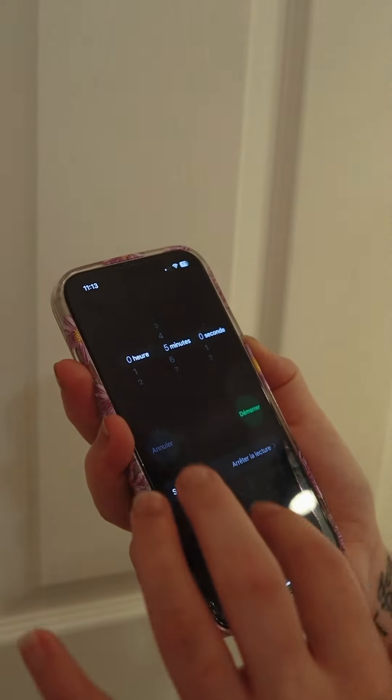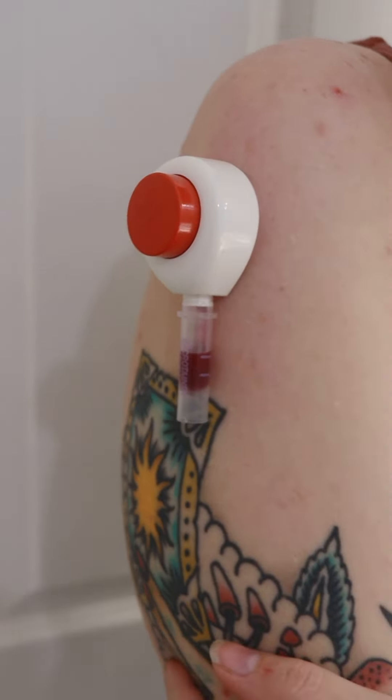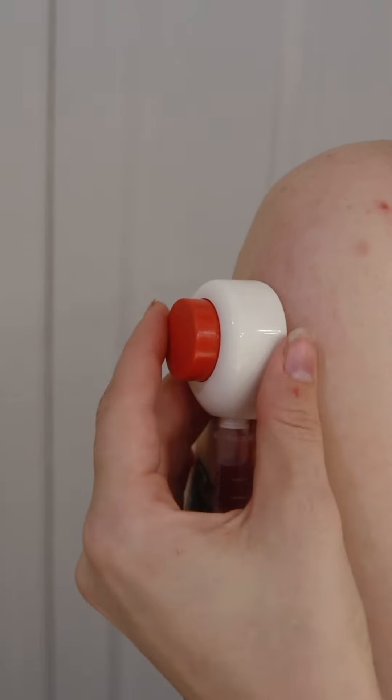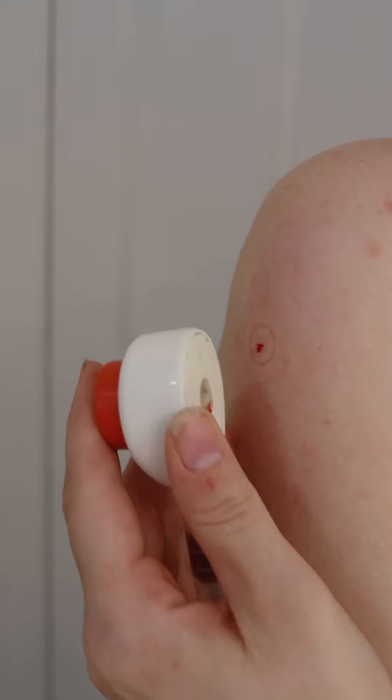There will be a collection time of a maximum of five minutes. Once the collection level is near or at the second line, remove the device. Slowly remove the Early Reveal tap by peeling it off from one side.